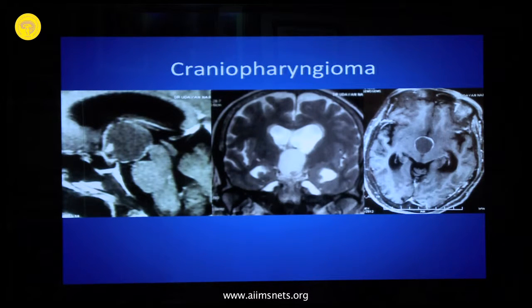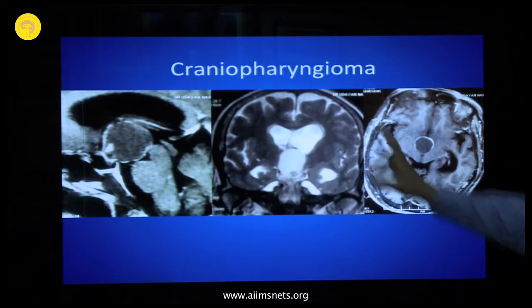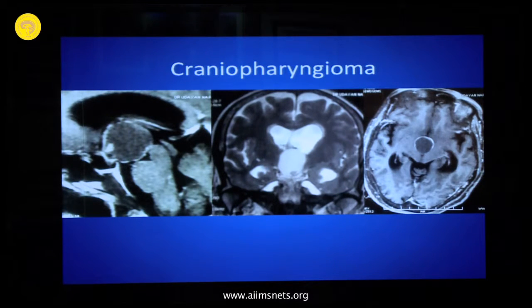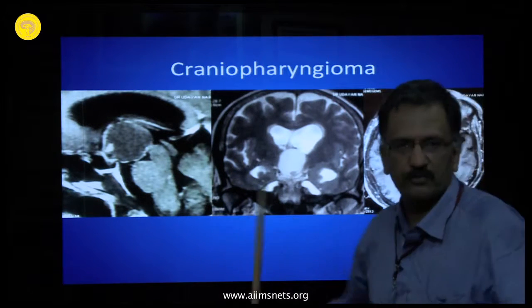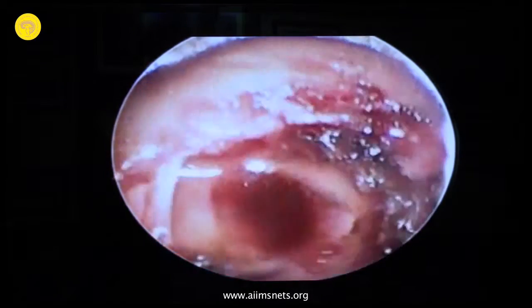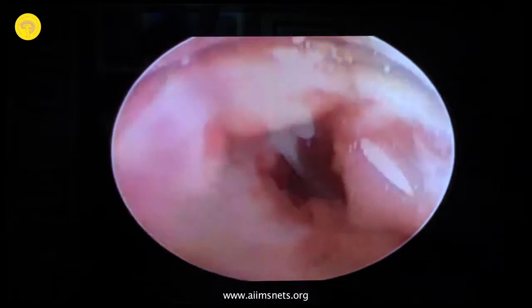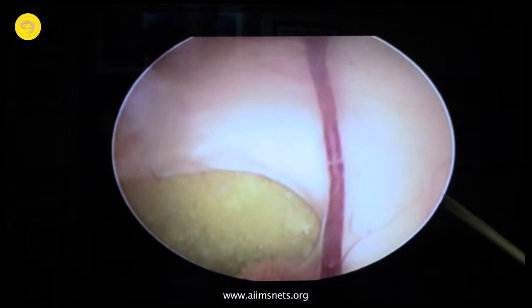Now, remarkable results. You take this tumor and you go in, do a microsurgery, but this is dilated, so just do an endoscopy, just to decompress it and give radiotherapy, remarkable results. After you see the follow-up, the whole thing is completely gone. However, what are the problems? So I'll just take you right from the burr hole to the space. So we're just going. We've reached the point, and this is the tube.